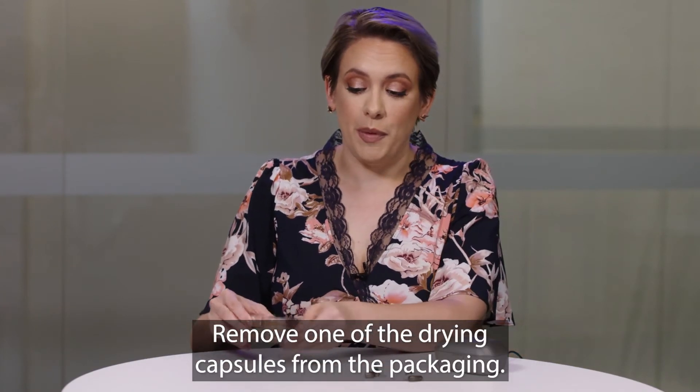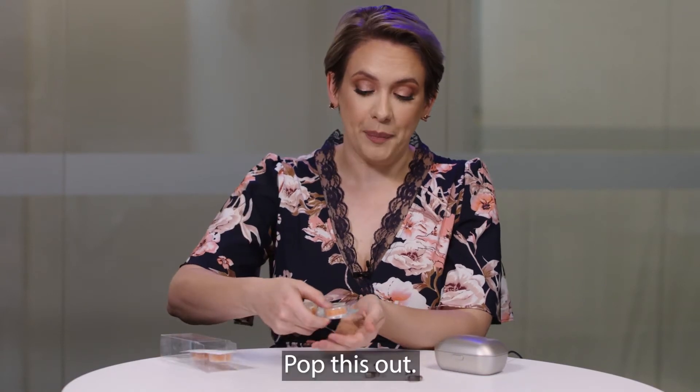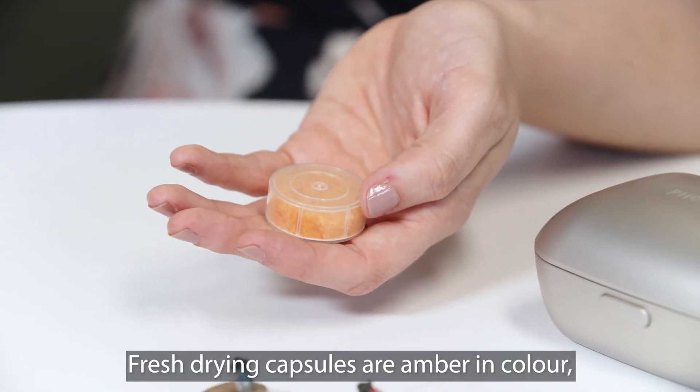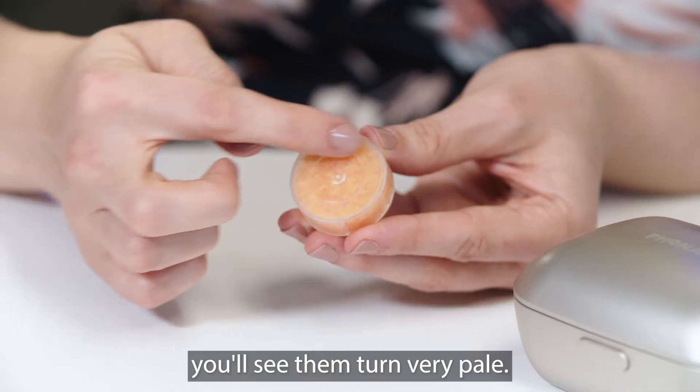Remove one of the drying capsules from the packaging and pop it out. Fresh drying capsules are amber in colour, and when these need to be changed you'll see them turn very pale.